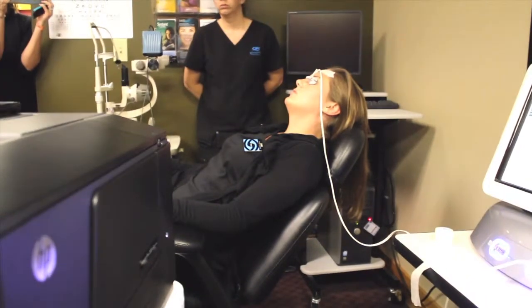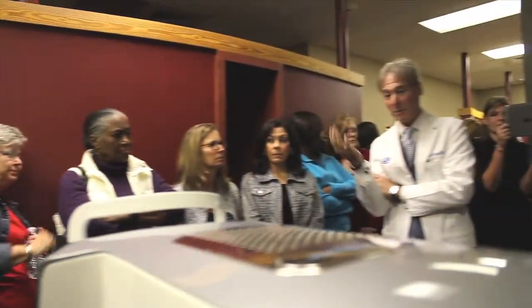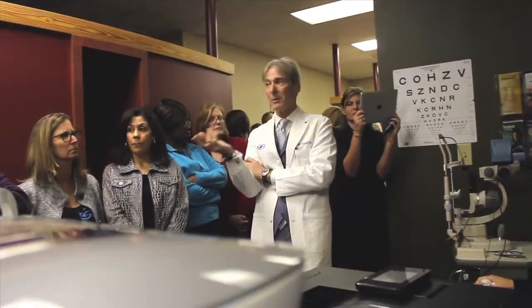Does anybody else use the bead mask? I use it twice a day. Oh no, they do that, everybody, yeah, we want you to use that. The problem again with masks is it's real hot at first, and it cools off real fast. And it's, like I said, we love the mask, as you know.